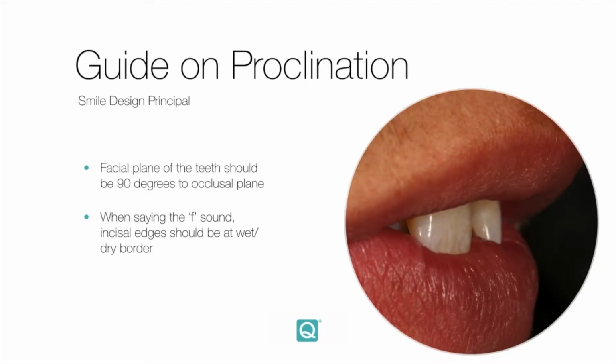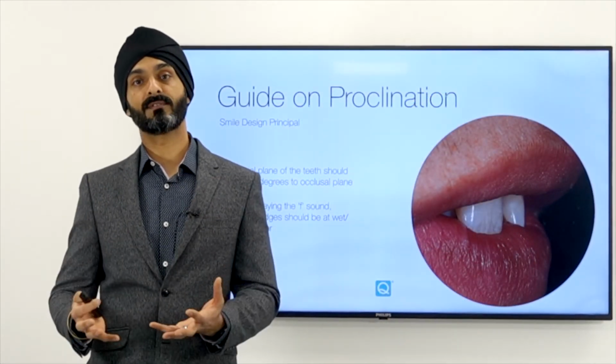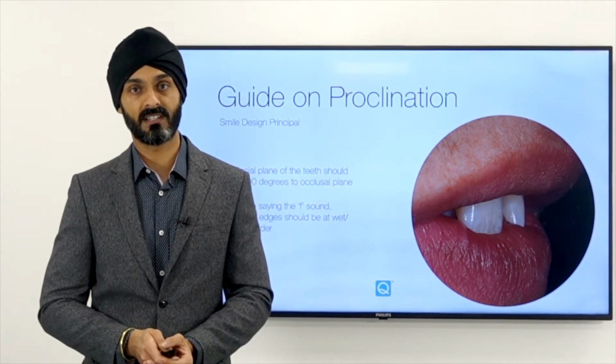So this is only really useful in skeletal 1 cases and very mild 2 and very mild 3 cases as well. And realistically, you should be taking all of this information into account and deciding on what the ideal treatment plan for that patient is.